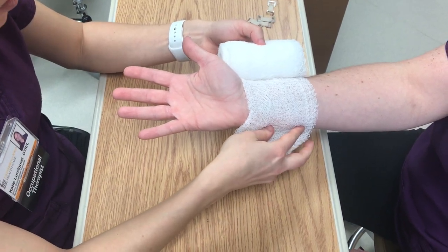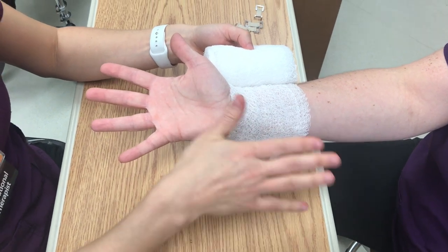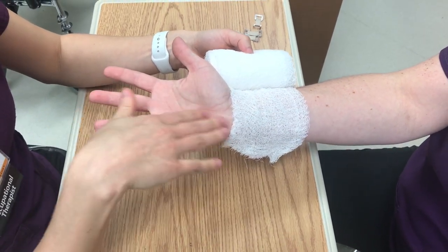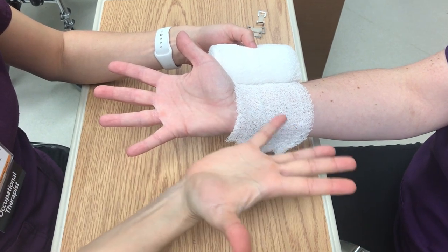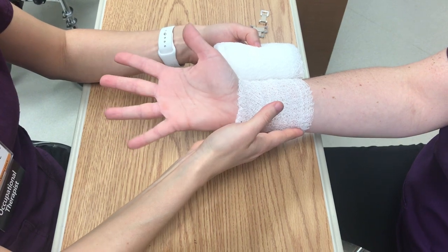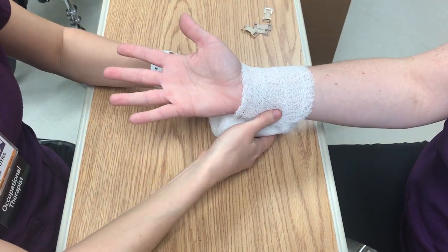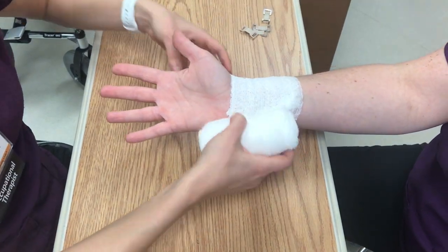We're going to show you how to wrap a hand after they've had grafting to their palmar aspect of their hand. This is helping to promote more extension of the fingers and palm. Using your dressing to help achieve the proper position we want.